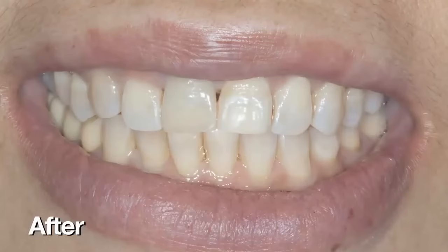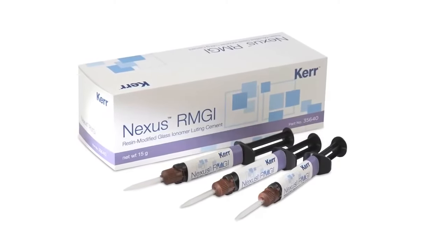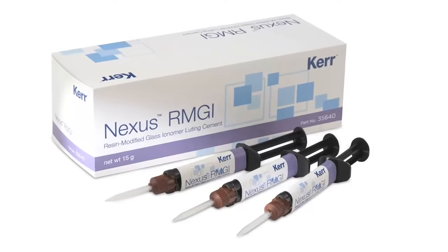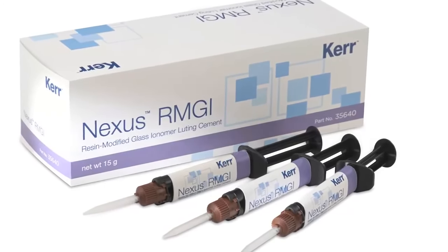And there it is, cemented into place with the Nexus RMGI. The ability to peel that off in one piece is a big advantage of this material. And of course, with the Nexus adhesive chemistry that many of us have come to know and trust, it's a really confident feeling and a simple, straightforward cement to use.